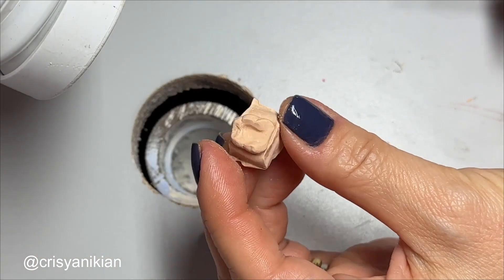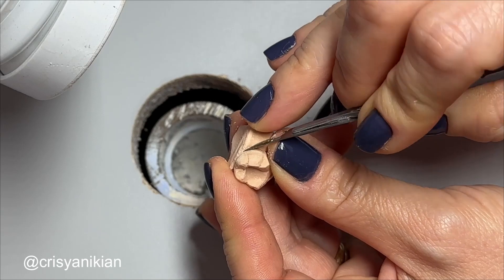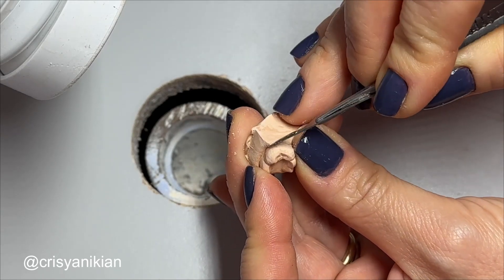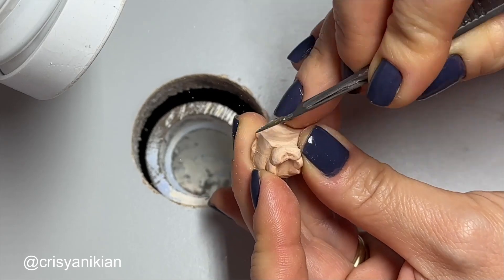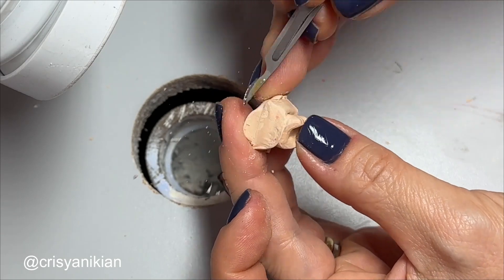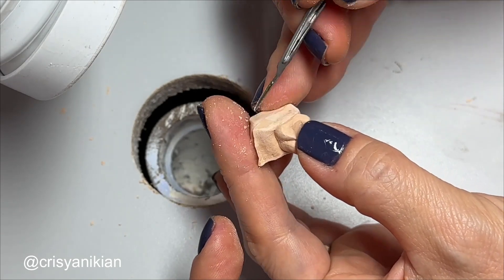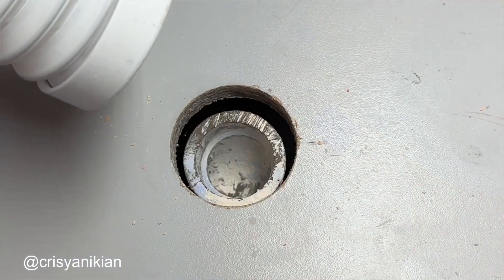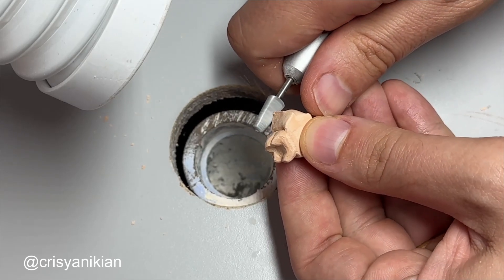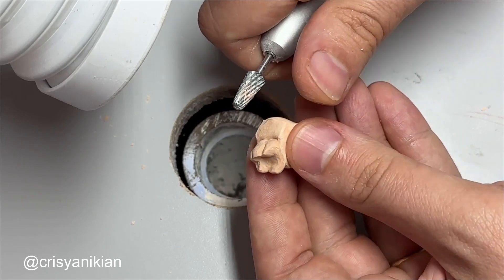Now let's turn it into a die. Use a thin blade, such as a number 15c scalpel blade mounted on a scalpel handle, to remove the plaster around the cervical area of the tooth, which is the gingival margin. Expose the maximum crown of the tooth. Then use a tungsten carbide burr for a handpiece, known as a maxi-cut, to cut out the cast we just made, applying it parallel to the tooth's long axis, wearing down all the plaster around the area where the tooth root would be.